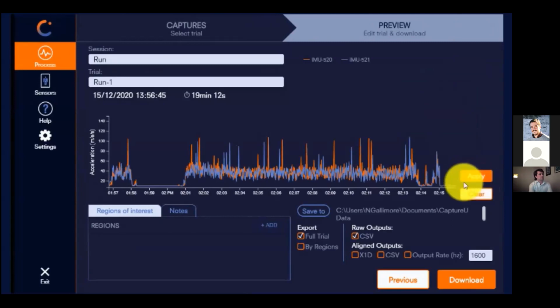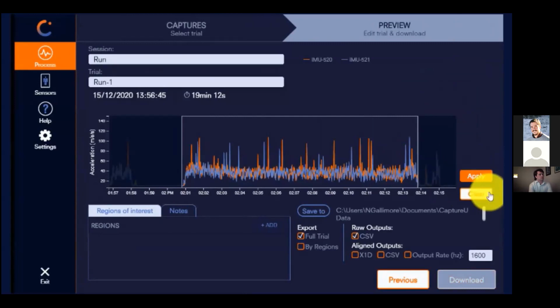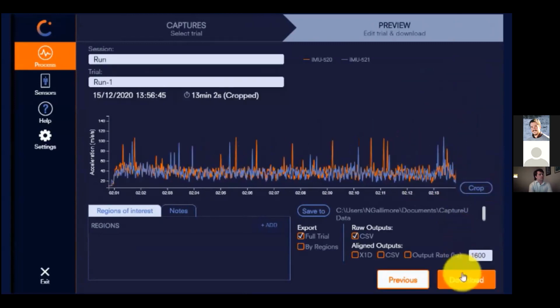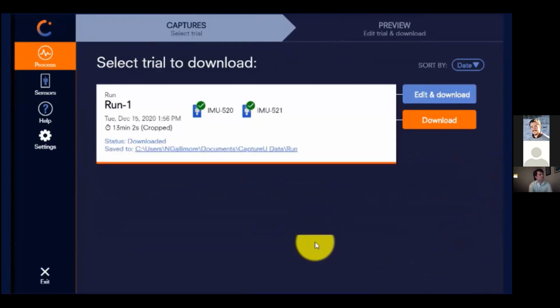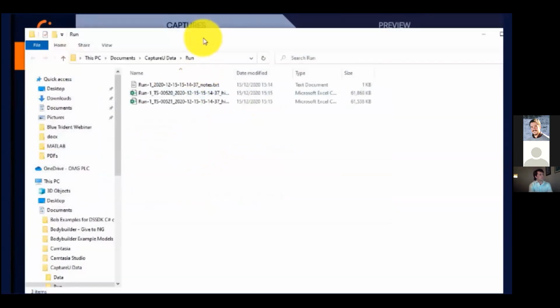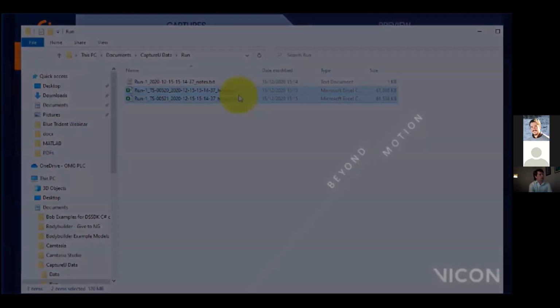I can crop the data to my region of interest, like so. And I can just simply click Download. This exports the data to a specified location, which can be accessed by clicking the hyperlink available on the trial. Here you can see we have our 2 CSV files exported, one for each sensor containing high G accelerometer data.